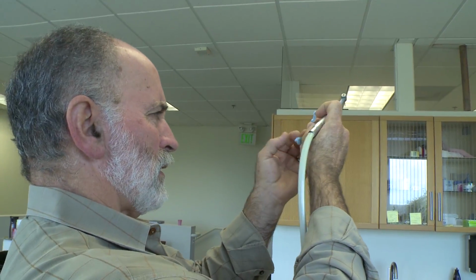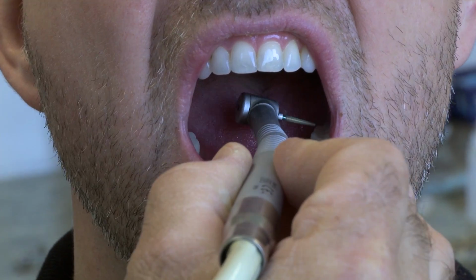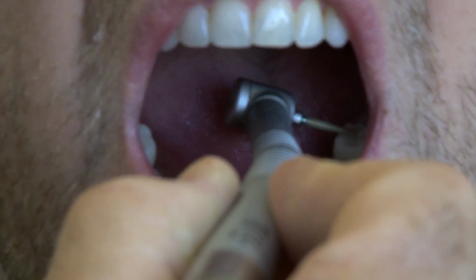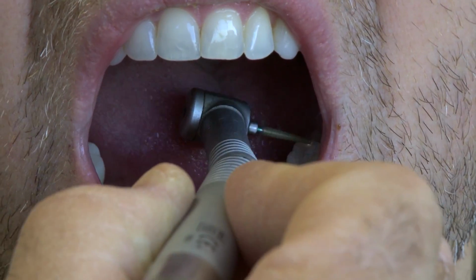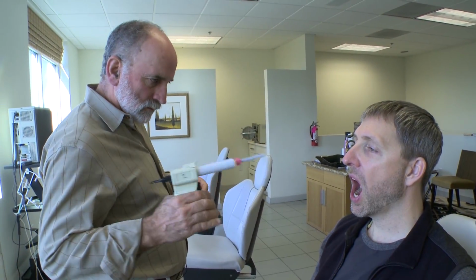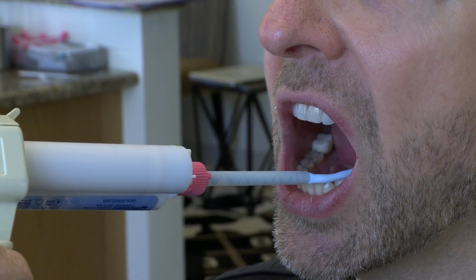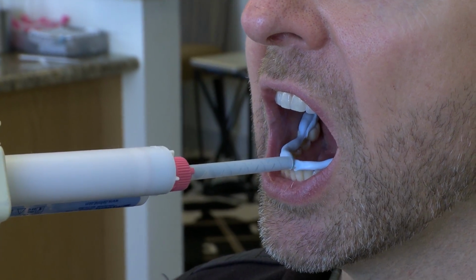Yeah, what do we notice? Let's see, one more speck here. Let's move a little further back. These crowns are a ceramic material that's very, very hard.